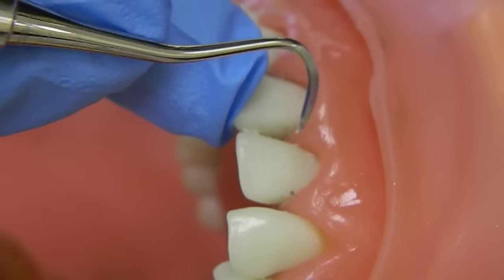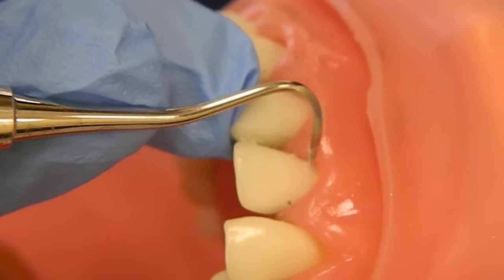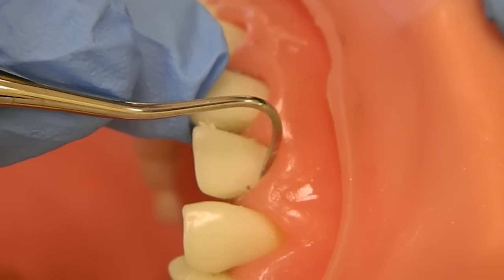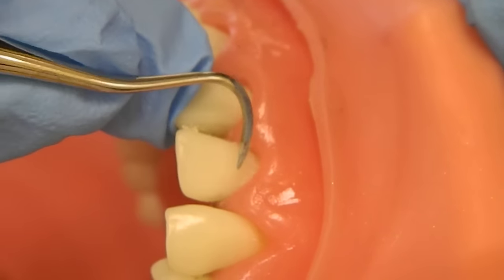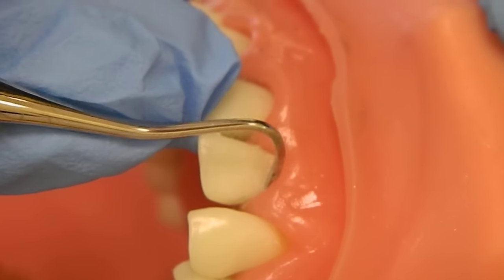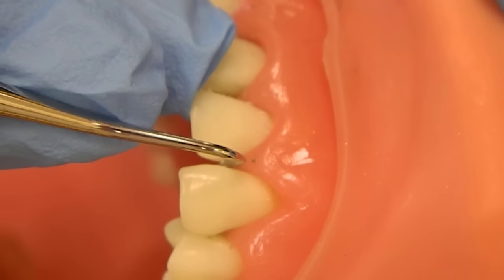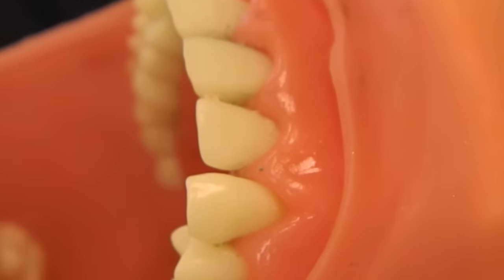Now at tooth 11 at 12 o'clock, doing the away surfaces, again starting a little bit before the midline on the side of the tip. We have to turn really fast — you can see how fast we really have to crank that instrument. Turn into the tooth, feeling that proximal surface, and that is your anterior teeth.